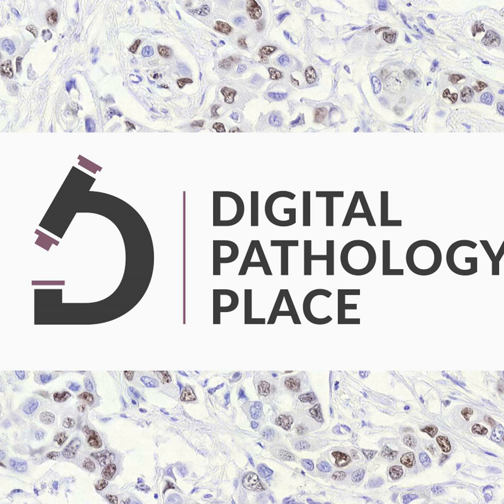So they trust the pathologist, and then by proxy, if the pathologist trusts AI, and that should be the case because it should be validated correctly, right? And then the pathologist should have trust and the final say, then patients are okay with this. And there are a couple of other very interesting insights. So clinical validity outweighed full algorithmic transparency. So meaning they care a lot less about knowing what's inside the algorithm if it's clinically valid.